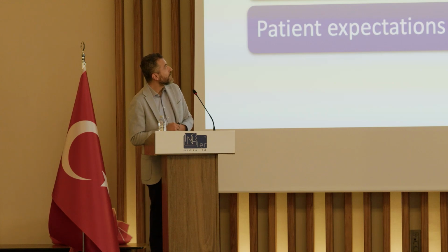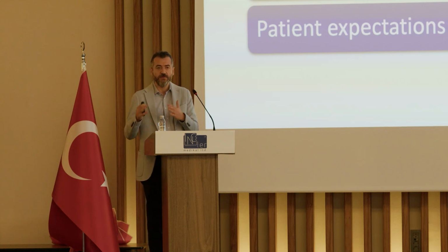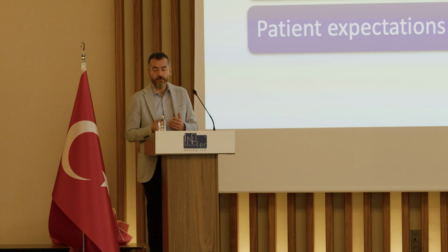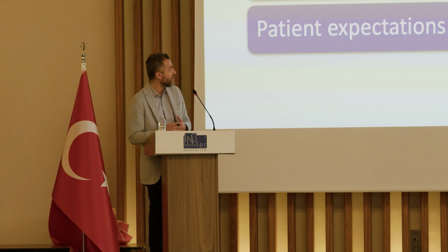First of all, one of the main reasons is that the results of shockwave lithotripsy vary a lot between operators. It depends on the device you use, the technique you use, and patient selection, of course. Also, we have very good technical advancements in urology. We now have high-power lasers, very efficient laser devices, fancy endoscopes that have very beautiful images, and patients now require more and more technology to get rid of the stone as soon as possible.